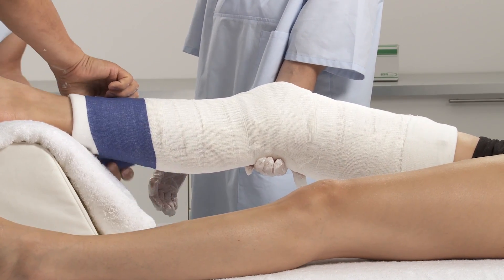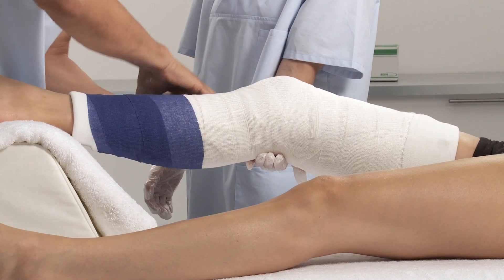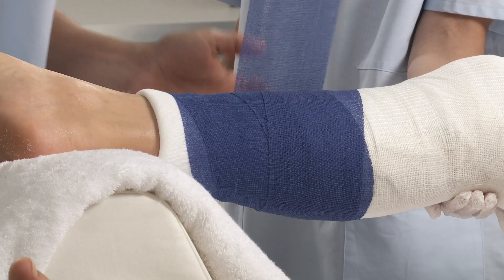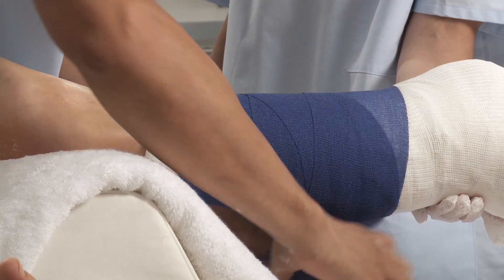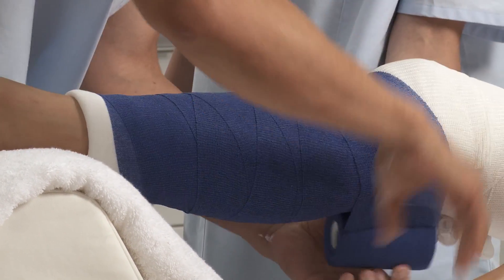Using another bandage, wrap around the lower leg moving proximally. Proceed up the thigh, overlapping by 50%, and fix. Use a second bandage if needed.